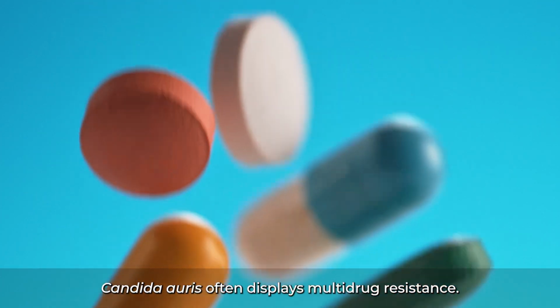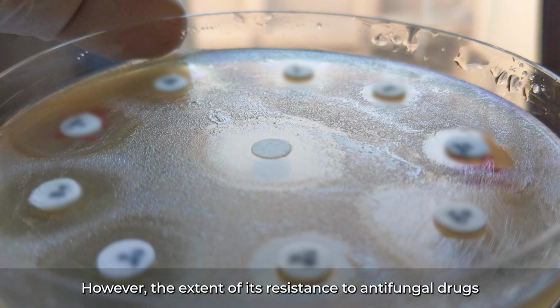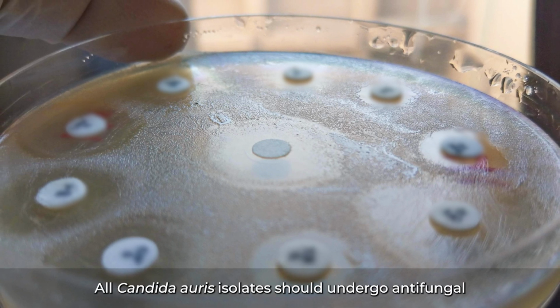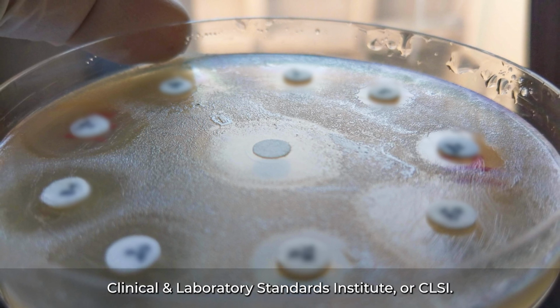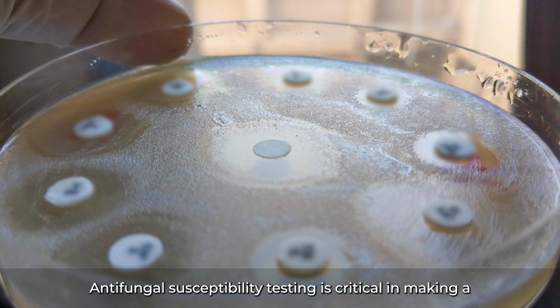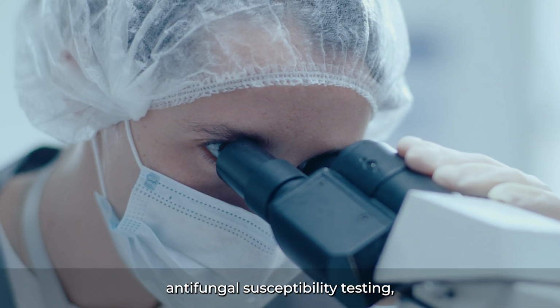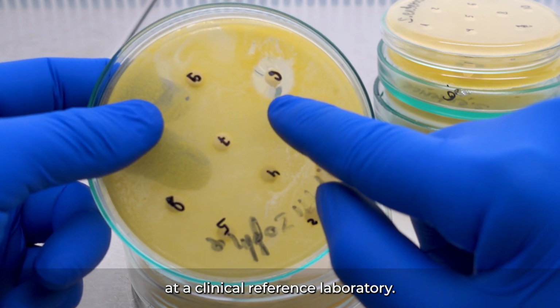Candida auris often displays multi-drug resistance. However, the extent of its resistance to antifungal drugs can vary greatly among isolates. All Candida auris isolates should undergo antifungal susceptibility testing, following the guidelines set by the Clinical and Laboratory Standards Institute, or CLSI. Antifungal susceptibility testing is critical in making a clinical treatment decision. If your lab does not perform antifungal susceptibility testing, the clinician may order additional testing at a clinical reference laboratory.